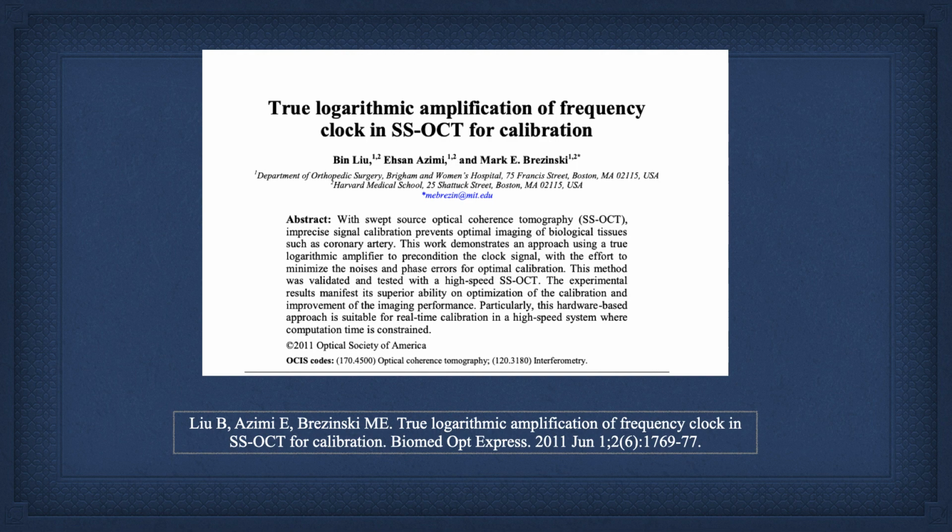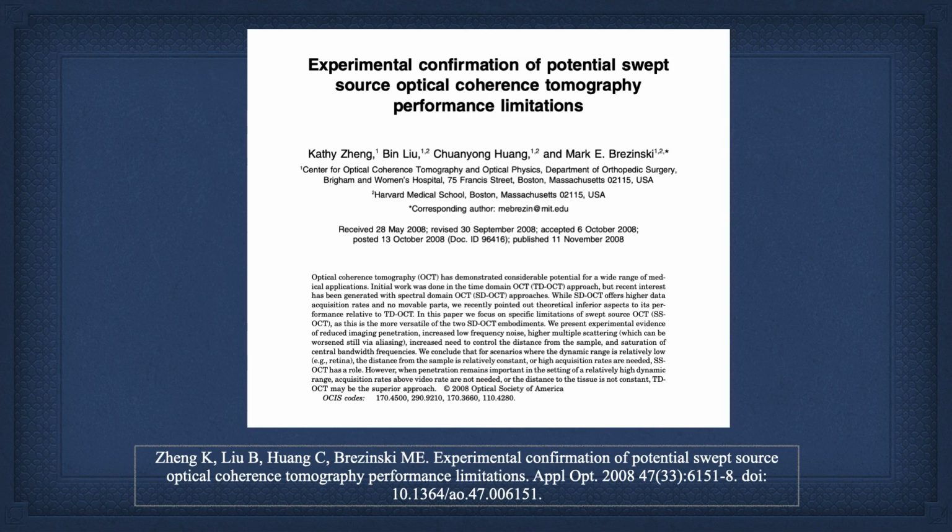Now, one thing we tried, which we did do, was put a logarithmic amplifier inside the SS-OCT system, and it helped the performance, but it's not going to get us to where time domain is. And there's a series of papers, and I'm just going to go through these rapidly, and I'll tell you why in a minute.